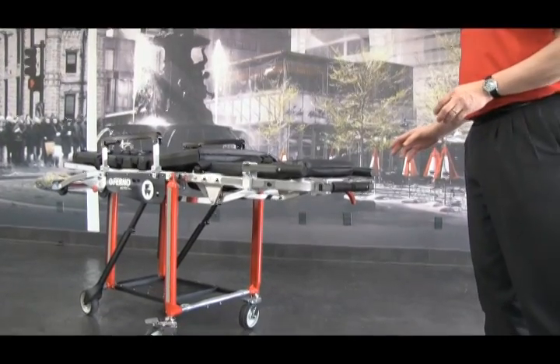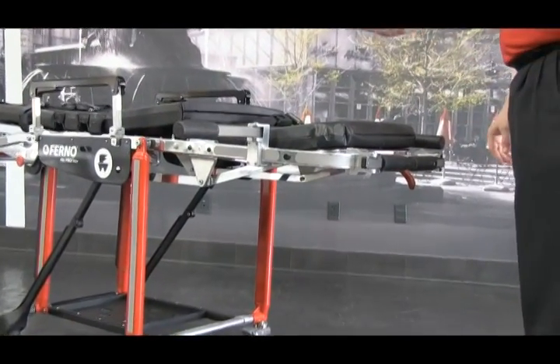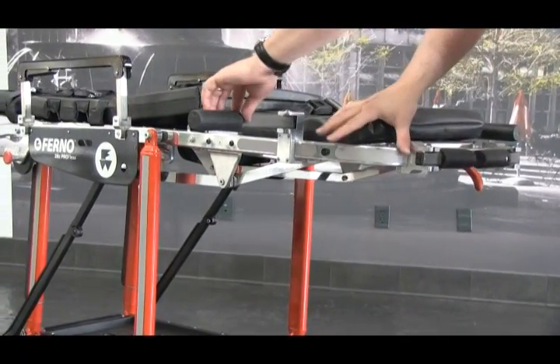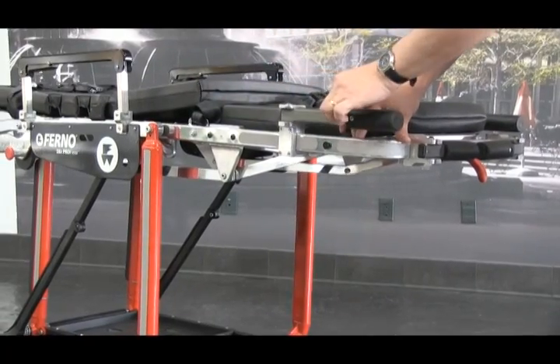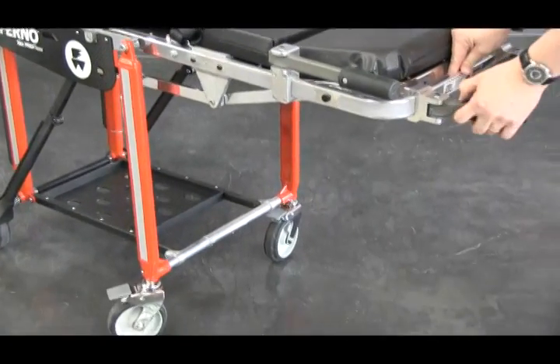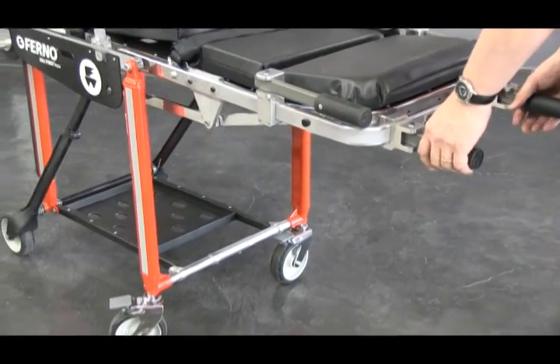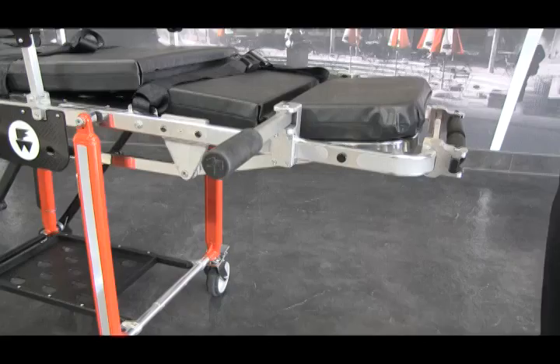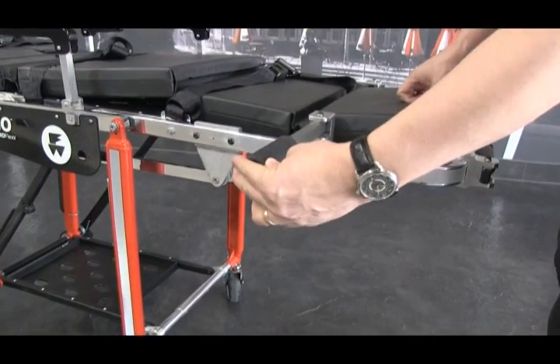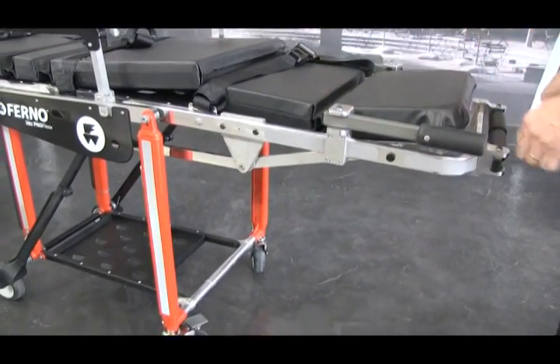There are two optional flip-out handles for the Model 28Z. The long side extension handle flips out to allow an extra operator to assist with loading, unloading, and carrying over rough terrain. To use the handle, pull out and release — it locks in place. For the shorter handles, the same action: pull out, release, locks in place. This gives operators a better ergonomic position to carry or help load the cot. The side flip-out handles are designed to be carried in a specific direction and not forced toward the head or foot of the cot. Be sure to pull the handle out to unlock it and let it snap back into place.